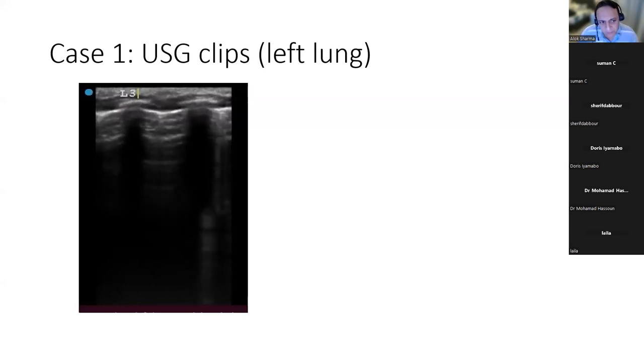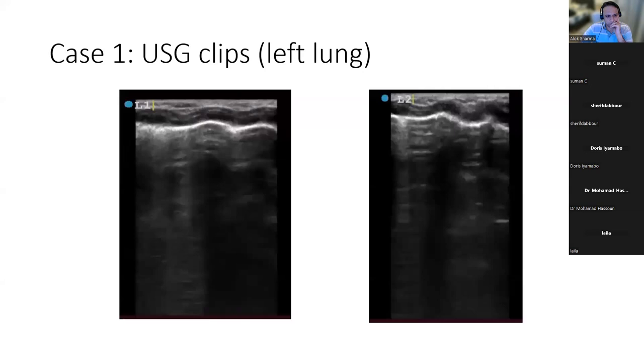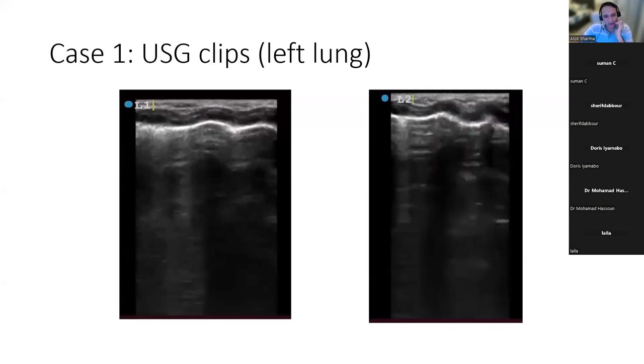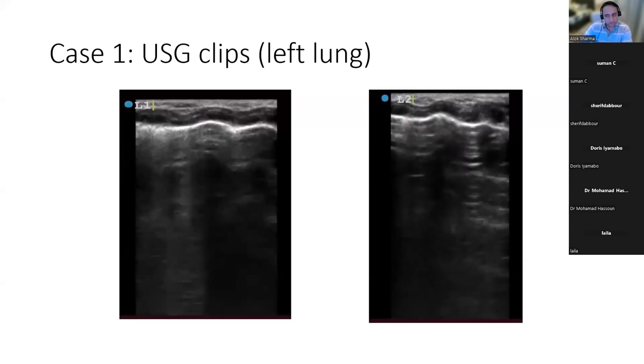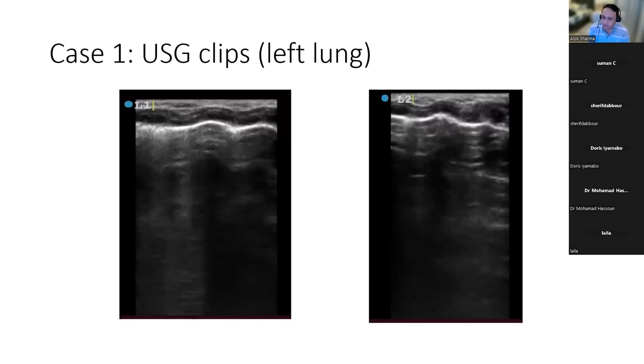Can we just go back to your previous image? Yes, actually, I was going to ask you that, because in the previous image it was showing well. So I suspect you're right, it's something to do with the jelly. What happens is you put gel on right at the start and you have a good interface. Then as you move, the gel gets left in the previous area. This is a really important point as you move: make sure you have decent gel contact. It's not about the amount, it's having a decent amount of gel between your interfaces.